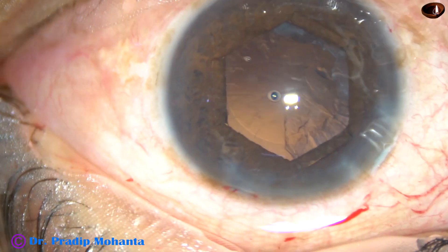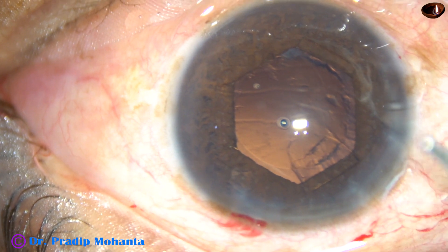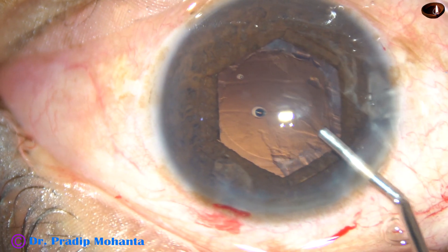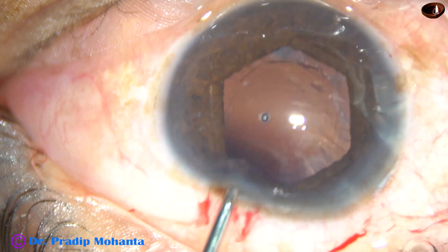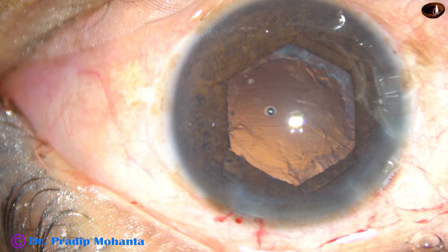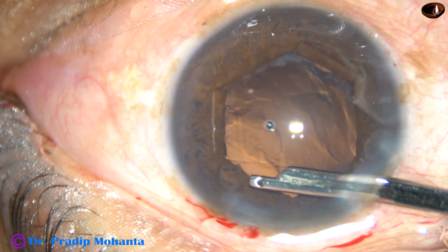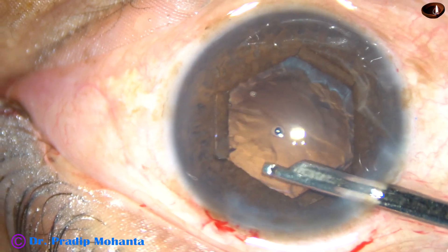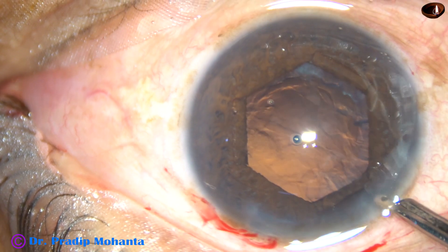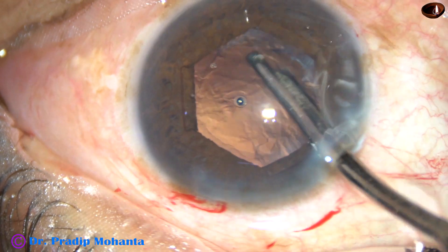In this case, vacuum was 350 mmHg, flow rate is 40 ml per minute, and ultrasonic energy is 45 percent. The nucleus and epinucleus have been managed and now, while my assistant gets ready with the bimanual irrigation-aspiration, I am going to use a Simcoe cannula to remove some portion of the cortex and a small nuclear piece.